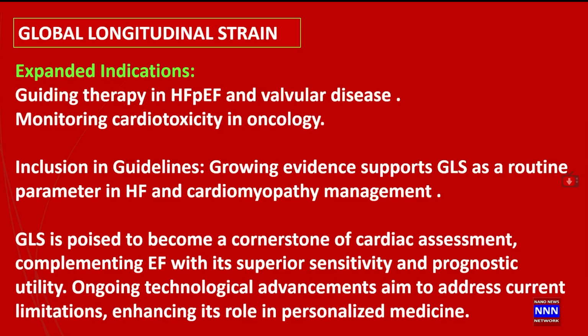And there's growing evidence that it should be included in the routine measurement of 2D echocardiography studies, especially in patients with heart failure and cardiomyopathy. It is poised to become a cornerstone in cardiac assessment, complementing ejection fraction with its superior sensitivity and prognostic utility.